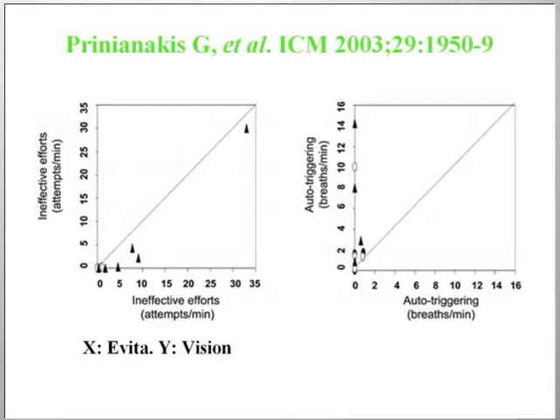Nevertheless, the price they had to pay was a significantly higher number of auto-triggered breaths when the patients were ventilated with this new sophisticated ventilator having such a sensitive triggering mechanism.